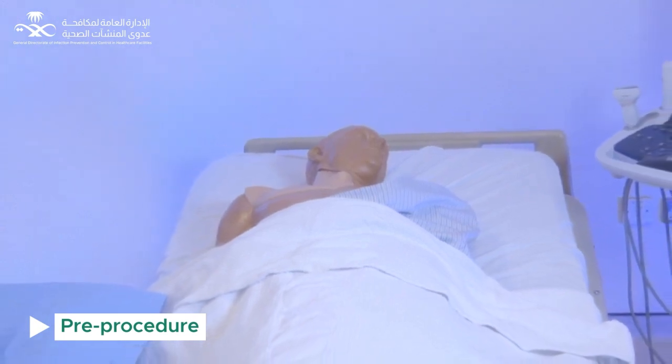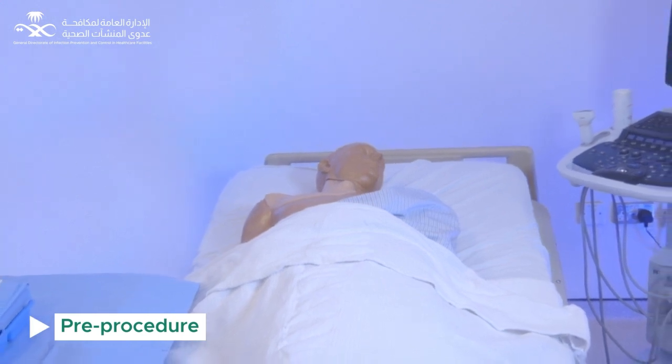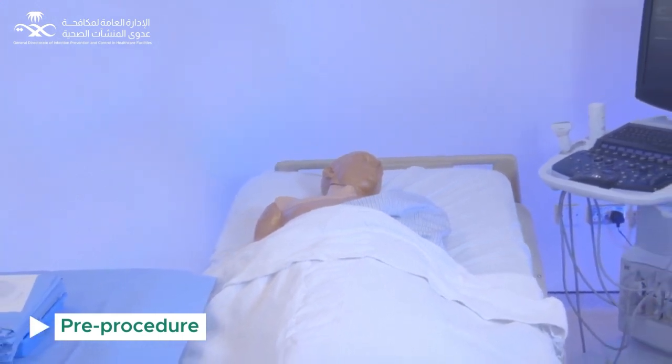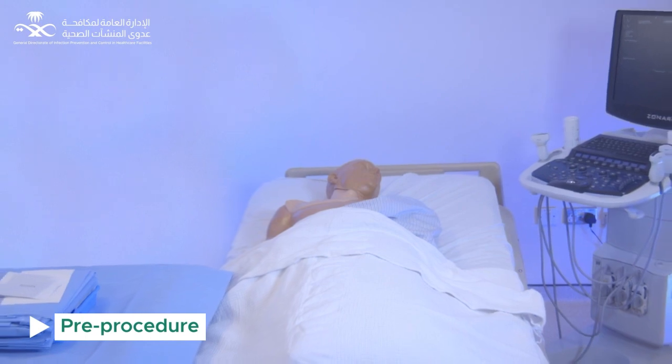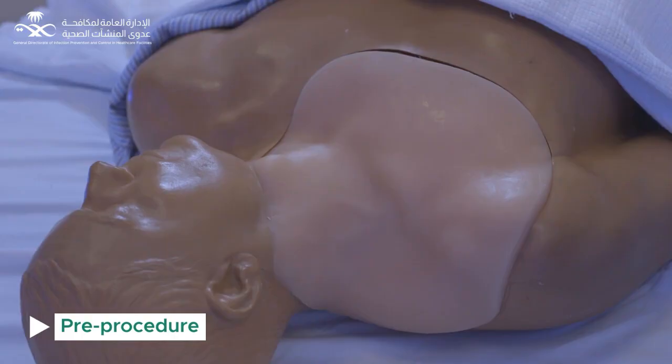Assess the proper access site for central line insertion and avoid femoral site. Subclavian site is recommended for central line insertion. Place the patient in the required position to match the selected access. Inspect the site of insertion to rule out any local site infection.